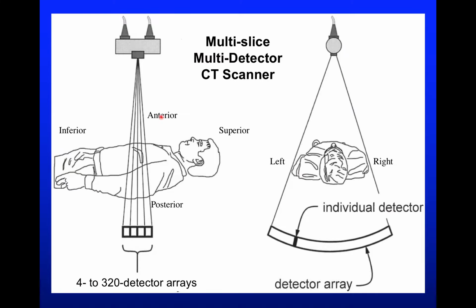Take note of these coordinate systems because they'll come up. When a patient is lying down like this and you look at the image, the coordinates that should be in your head are superior to inferior, so the top of their head to the tip of their feet, anterior to posterior. If we had a dorsal fin, it would be on our posterior side, right? We don't. And then left and right. Okay, and so that forms the 3-space.